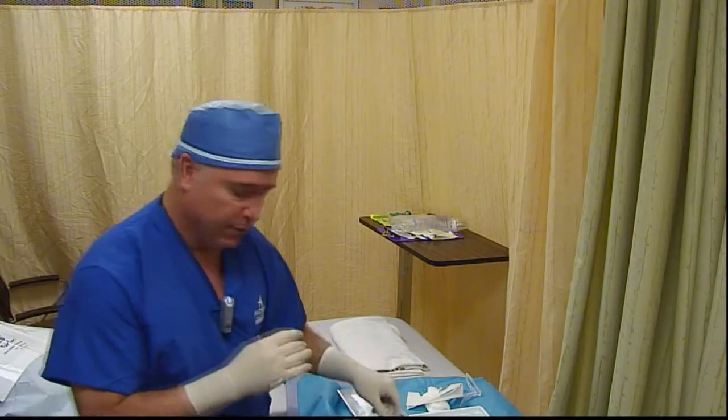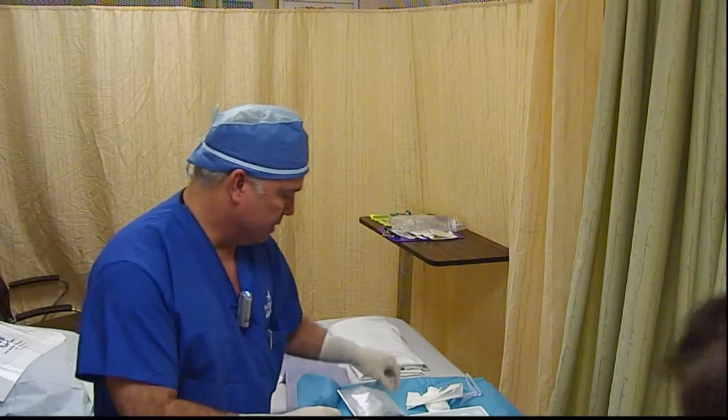Last time we did his initial block and told him to turn his pump on when he went to bed. He tried to prolong the duration of his pump, so he waited until he started feeling pain. He said he wasn't going to do that this time — he's going to go ahead and turn it on when he goes to bed so that the block doesn't wear off before his pump is working, because he learned the hard way that if you let that wear off it starts getting pretty painful before the pump will kick back in.